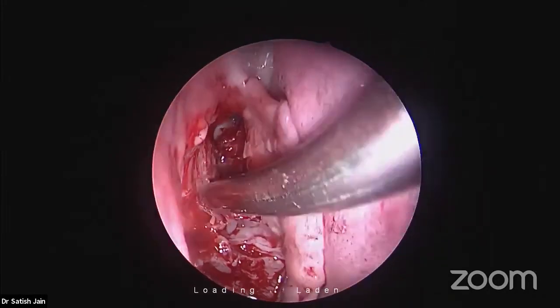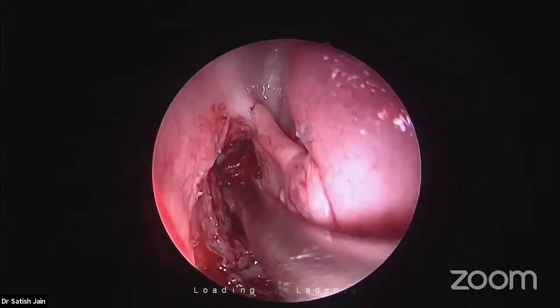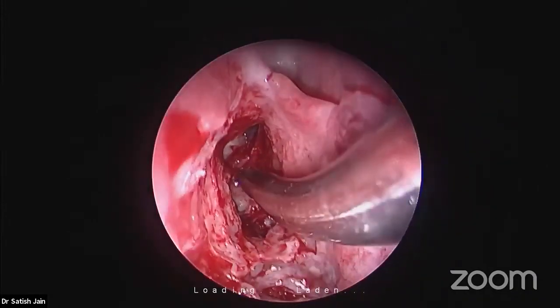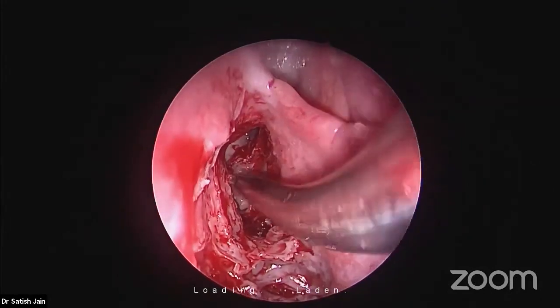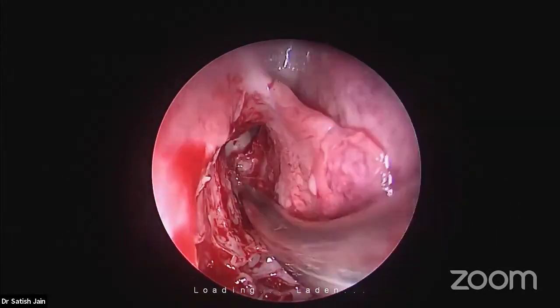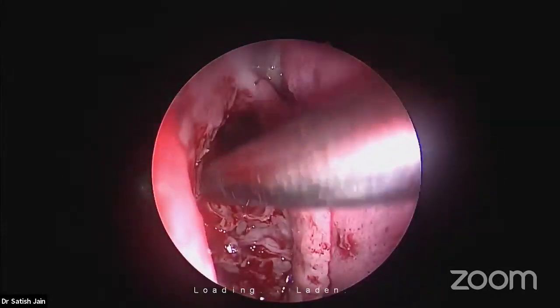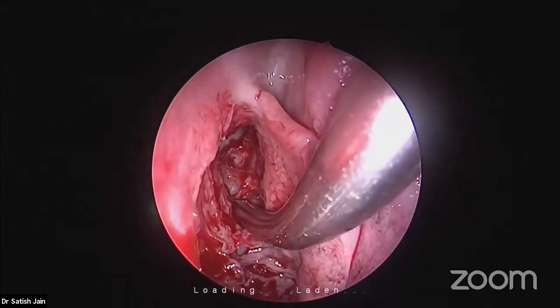This is the simplest way of carrying it out. What I perceived, Satish, is that the fovea, the retrobullar recess, and the suprabullar recess represent the same anatomical part posterior to the bulla, from above all the way downwards.